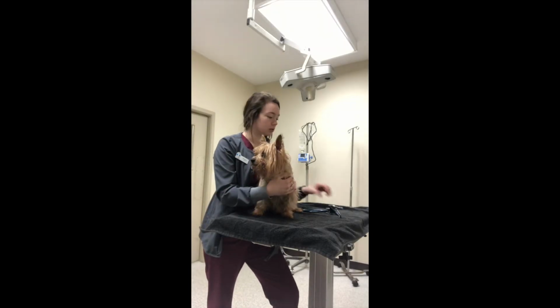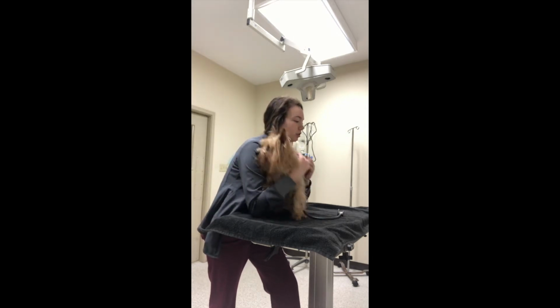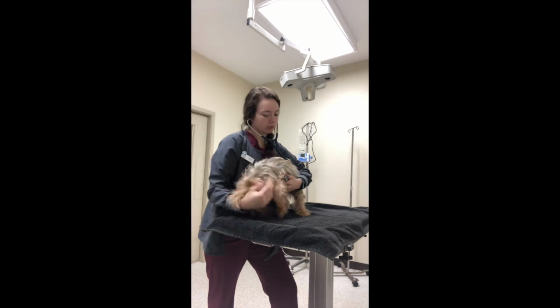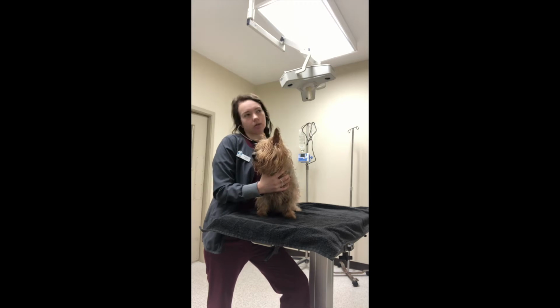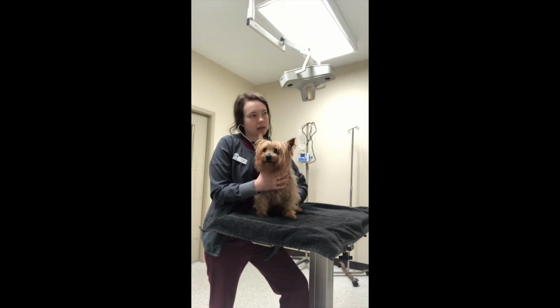I'm going to auscultate the lungs and the heart. I'm going to start with the heart, and I'm going to start listening to the right side at where the elbow meets the ribs. And I'm going to listen to the rhythm to make sure each beat is followed by identical time intervals. And I'm going to move over to the left side.